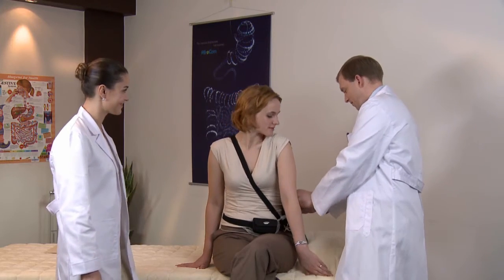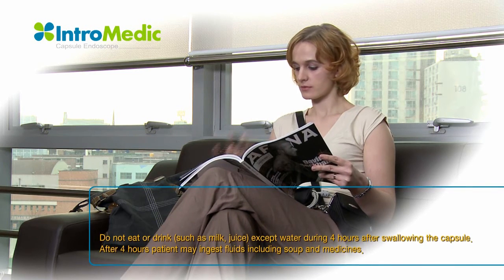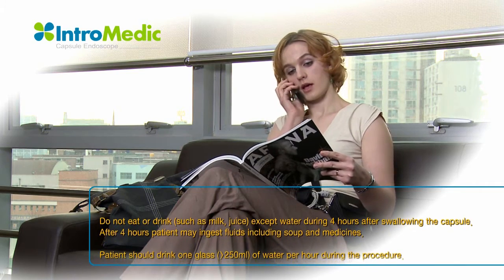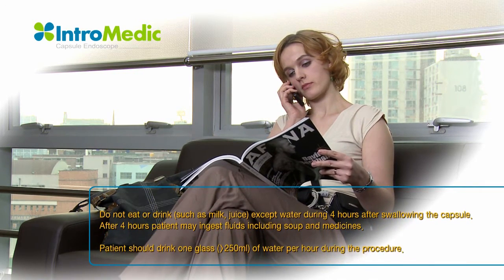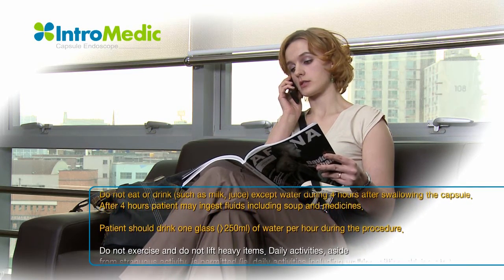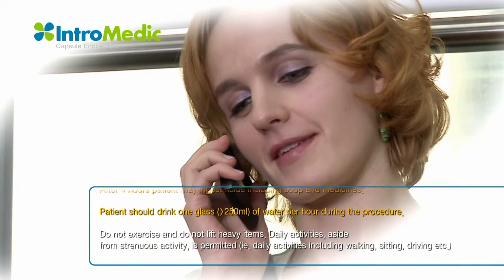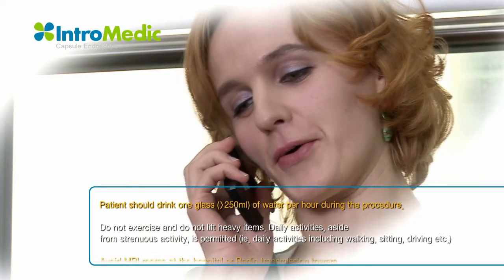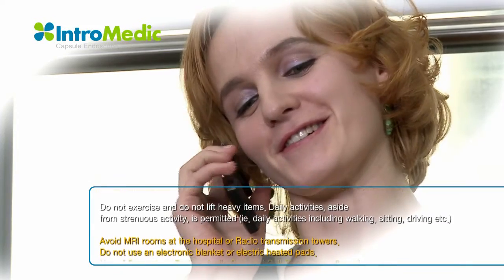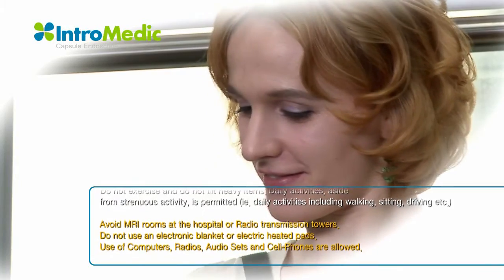After completing ingestion of the capsule, the patient should be informed what to do during the procedure. The patient should drink at least 250 ml of water every hour during the procedure, beginning from the first hour. After 4 hours, the patient can start with light food or a liquid diet. Do not exercise or lift heavy items. Daily activities aside from strenuous activity are permitted, such as walking, sitting, and driving.